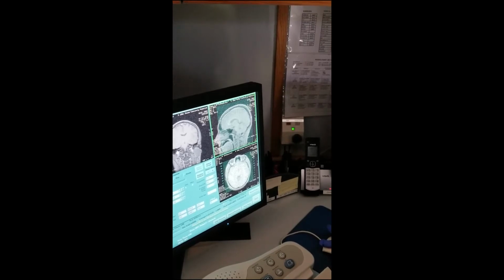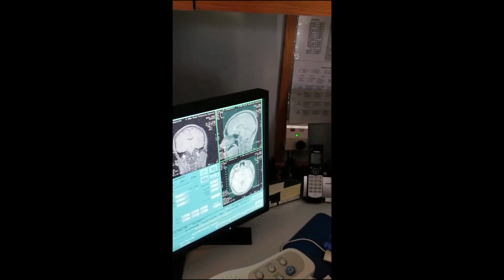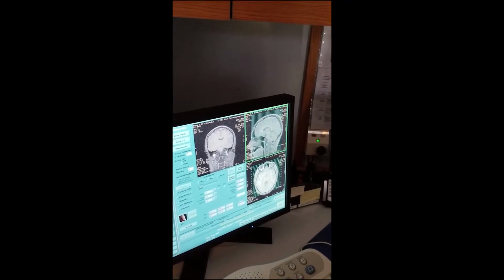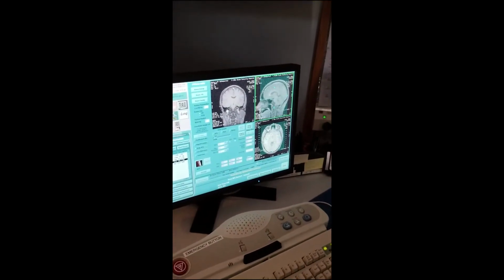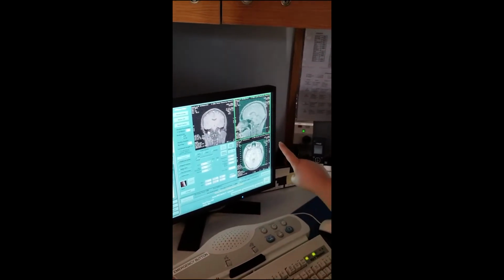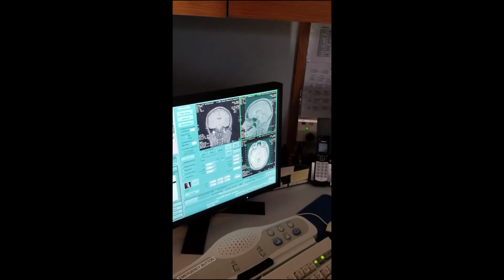I'm good here. Now, remember, the direction is very important. We said we want to go from the back to the front, right? So that's the key. This should be 1, and this should be whatever it is, 27 or 28. So there is no sat band needed. The only sat band in the brain is just the axial. No other sat band. Is this going to be transverse to the corpus callosum? There is no angulation needed because the head is not tilted that badly.